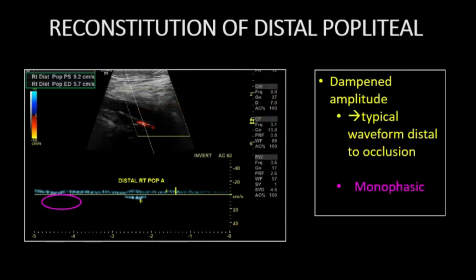In this patient, superficial femoral artery occlusion was encountered, but as is often seen, profunda femoris collaterals reconstituted the popliteal artery distally. The waveform is abnormal but flow is detected. Clearly, the amplitude is severely diminished.